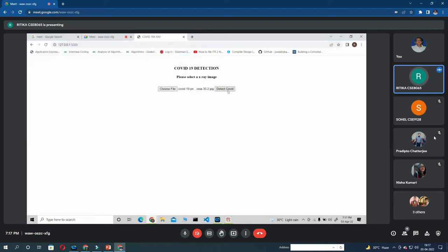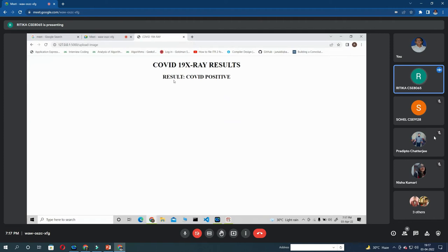And then we have to click on the detect COVID button. So it will show the result that the x-ray is of a COVID positive person.